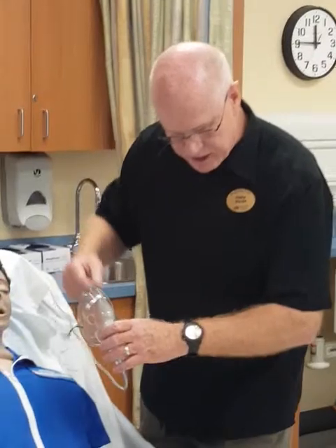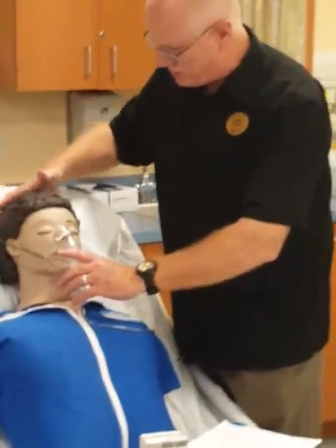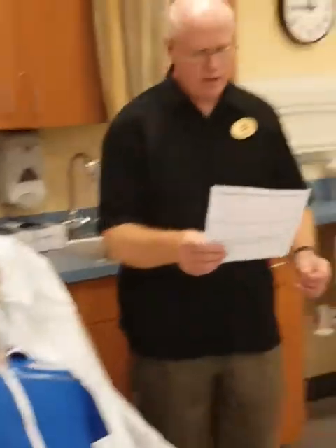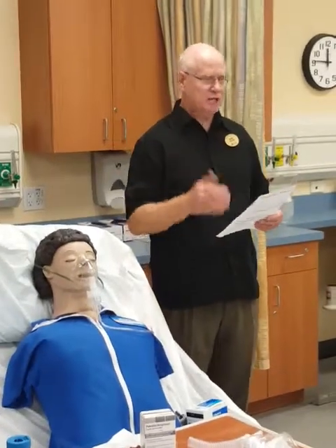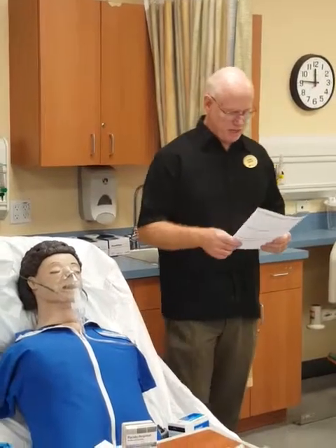Place the mask on the patient's face and instruct the patient to breathe normally, periodically holding their breath for up to ten seconds. If possible — some of these patients can't hold their breath at all — but once in a while, breathe in and hold your breath, just to help get some of that medicine deposited.